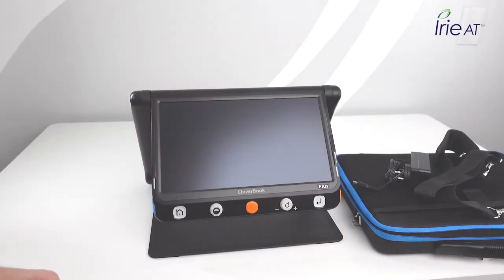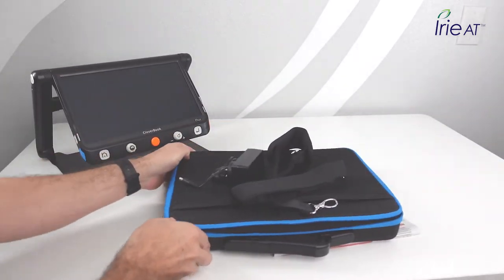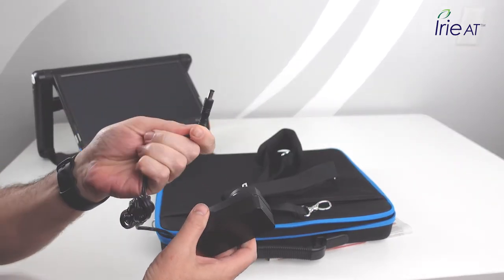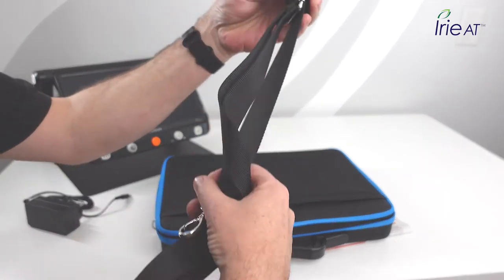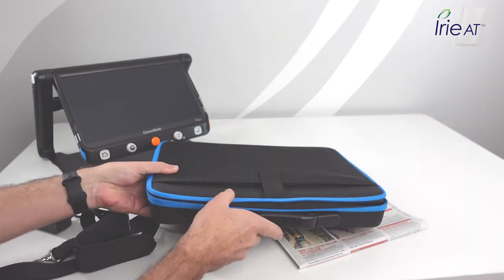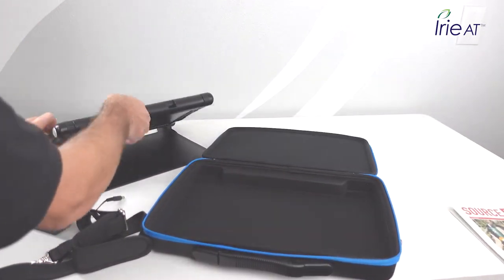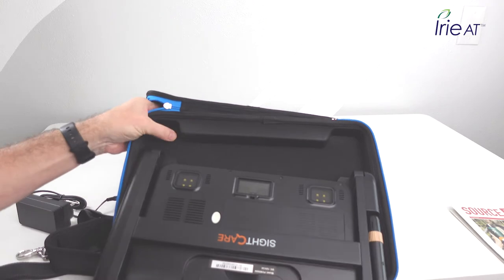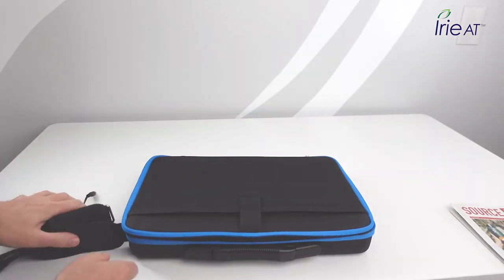Let's start out and see what we get in the box. First, we have the magnifier itself. You get a power charger — it has a round tip so you can't put it in the wrong way. You also get a shoulder strap for the case that connects on either side, a suitcase handle on the case, and the case itself. The case has an indentation shaped to fit the device so it fits right snug in there. Close it up and take it with you.